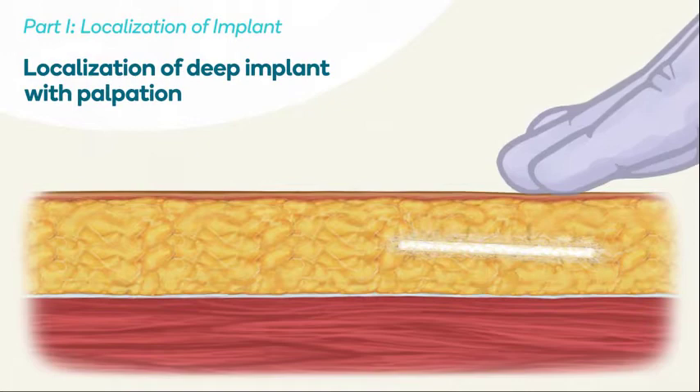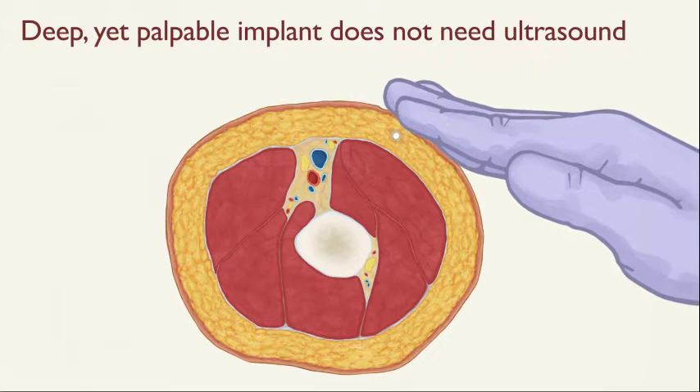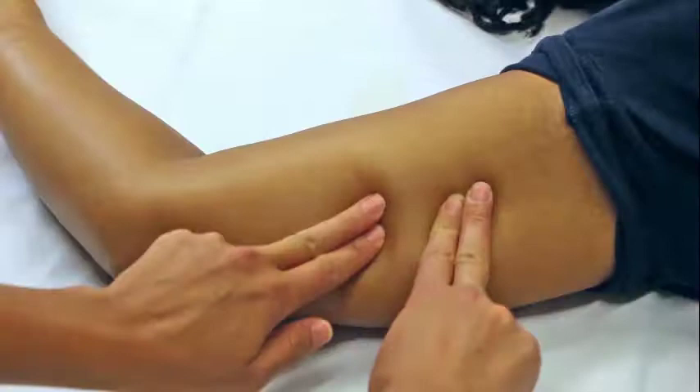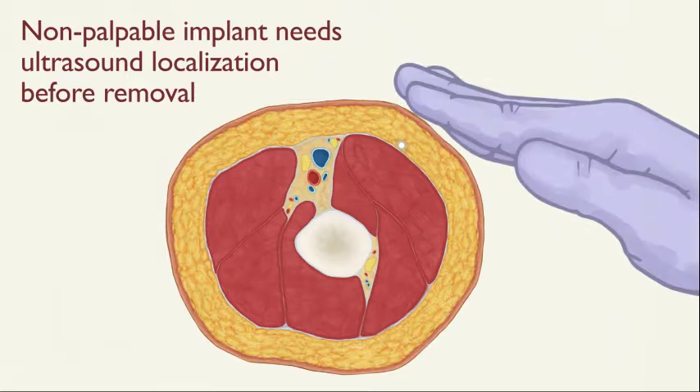Begin palpating for the implant by pressing near the proximal end to locate the tip of the distal end near the scar. If the implant is deeply palpable, you will not need ultrasound localization. Mark the position of the two ends of the implant, then mark the center between the two points for the incision site. If the implant is non-palpable, you will need ultrasound to locate the implant before attempting removal.